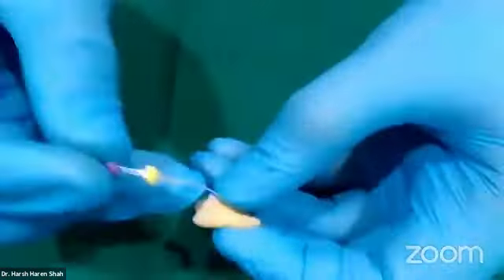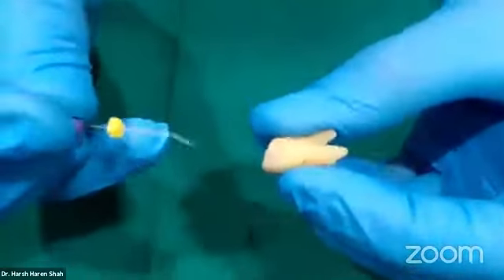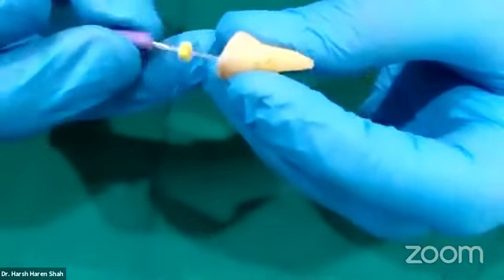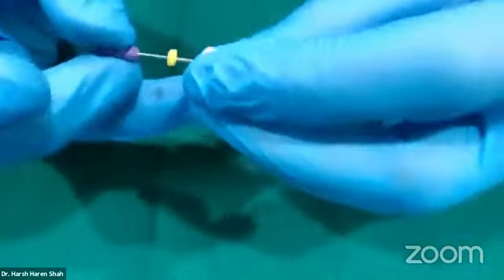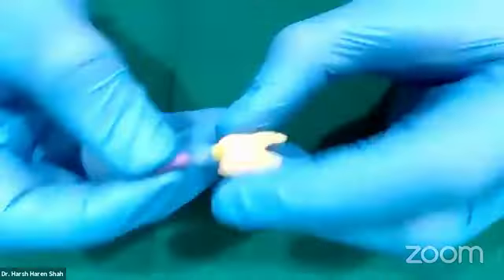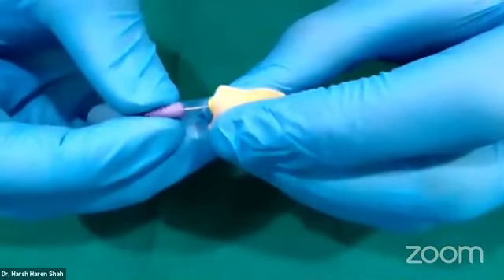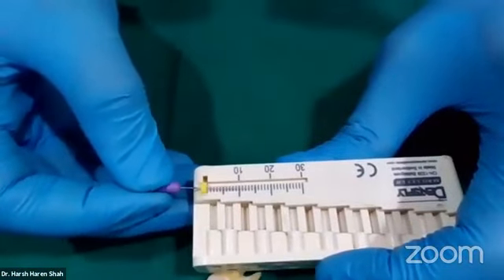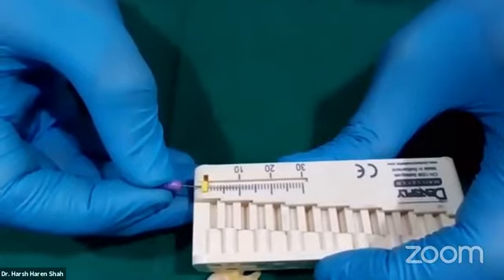Okay, let's start from the beginning for the palatal canal now. We've done mesiobuccal, distobuccal. Let's go to the palatal. So I will take my 10 number K file one more time. This is only to check that I have patency in the canal and my file can reach the complete working length. So the working length of this canal on the ruler, I expect it to be slightly longer than those. It is 16 millimeters. So I'll be setting all my stoppers to 16 for this case.